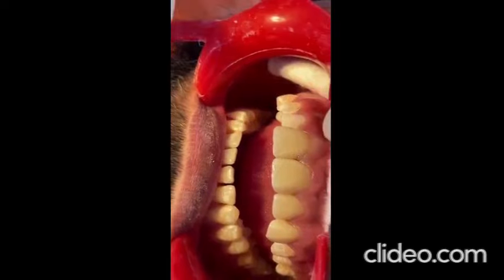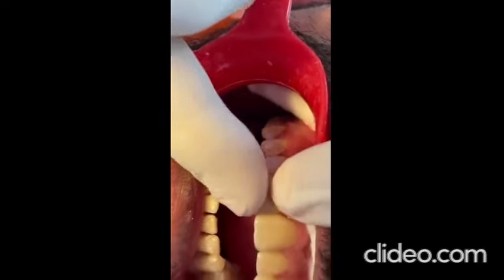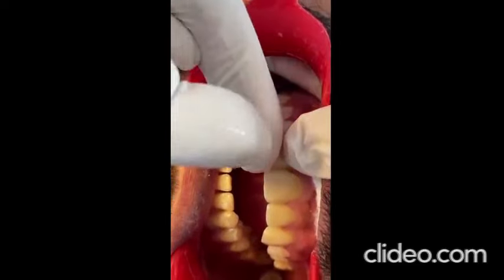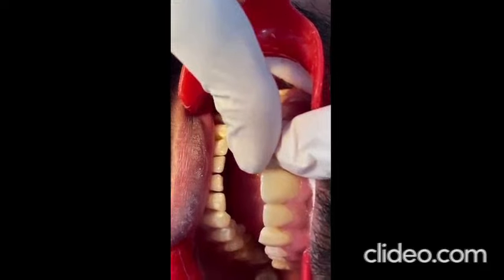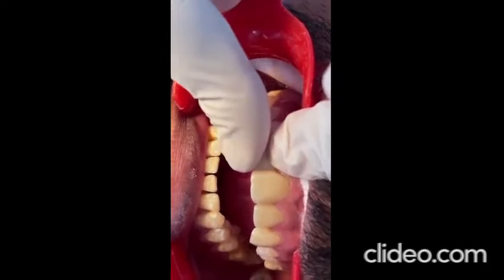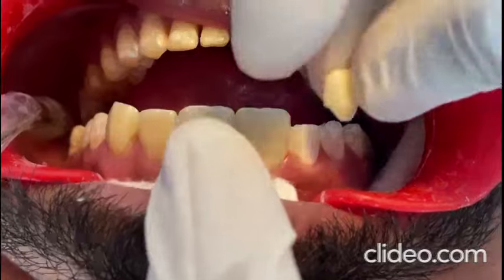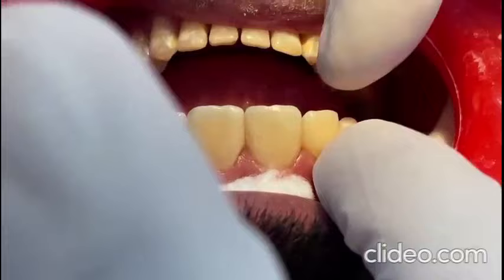The tooth is etched for 30 seconds with 37% phosphoric acid. In any etching technique, the complete elimination of the etching agent is of utmost importance. I recommend washing generously for about 20 seconds in order to remove all the acid debris that could be left.